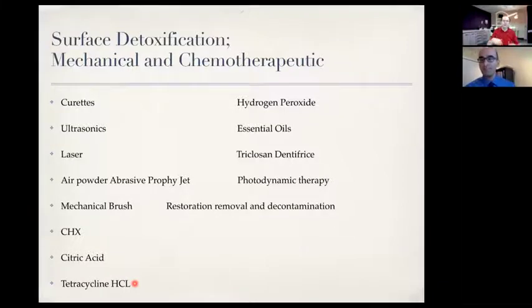In your practice, what tend to be the top treatment choices there? In my practice, for cases like peri-implant mucositis, what I do is non-surgical treatment. We use a variety of hand instruments like titanium curettes, because we should not use any stainless steel curettes that we use around teeth, around implants. We will cause more scratches and more problems around the implants. So titanium curettes or carbon curettes.